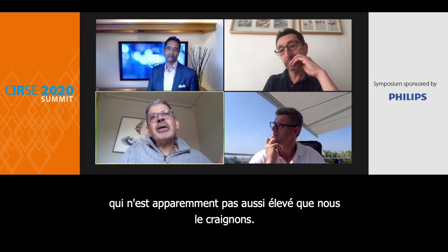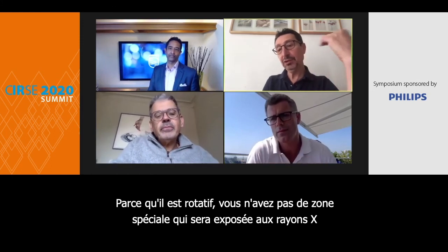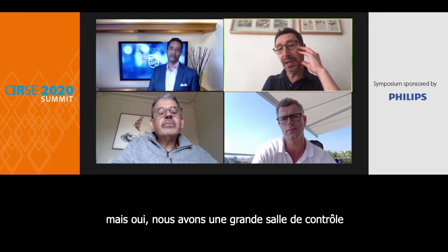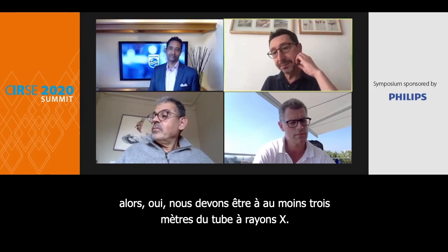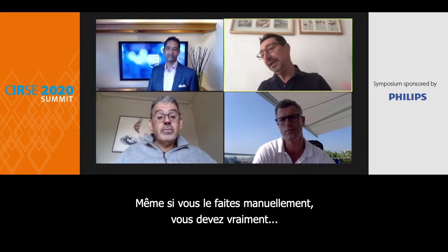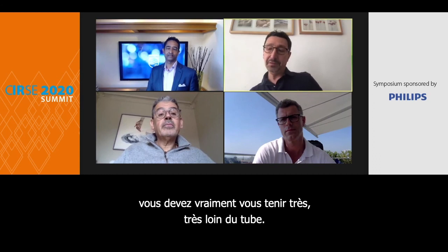But I know that Isham did some work on the radiation load from the cone beam, which apparently is not so high as we fear it is. Because it's rotational, you don't have a special area exposed to X-ray. But we have a large control room, so we can manage to go out in our settings. We need to be at least 3 meters from the X-ray tube. It's really, really important. Even if you are doing it manually, if you have long catheters and long microcatheters, you need to stand very, very far from the tube.